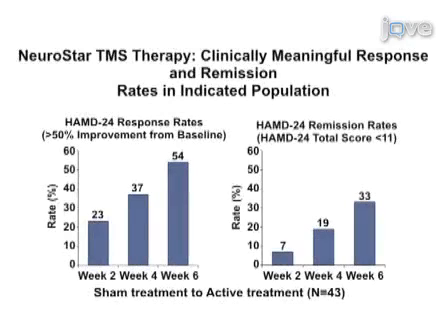Ultimately, results can be obtained that show a significant decrease in the discomfort and severity of several symptoms of antidepressant medication-resistant major depression through 4 to 6 weeks of treatment using the NeuroStar TMS therapy system. The implications of this technique extend towards the therapy of antidepressant medication-resistant depression as defined by the FDA clearance of the NeuroStar TMS therapy system.